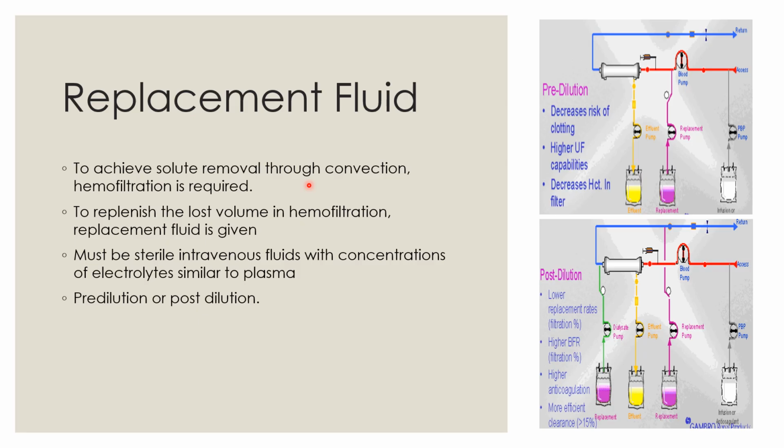To prevent hypovolemia, any water removed during hemofiltration must be returned to the blood before it reaches the patient, and this is called replacement fluid. Any fluid removed during hemofiltration is given back to maintain a net neutral fluid balance. Replacement fluid must be sterile intravenous fluids with concentration of electrolytes similar to plasma.